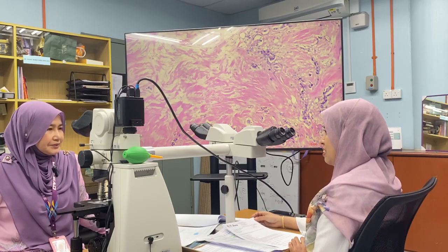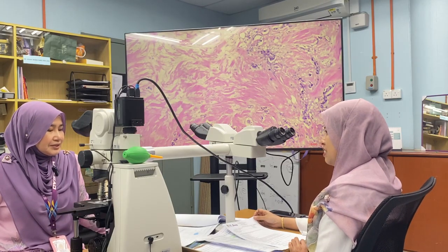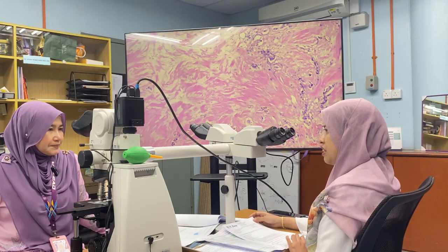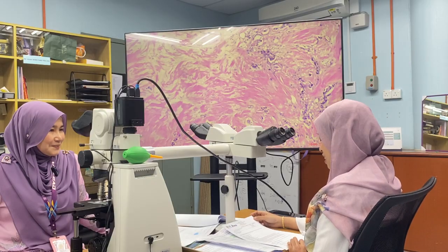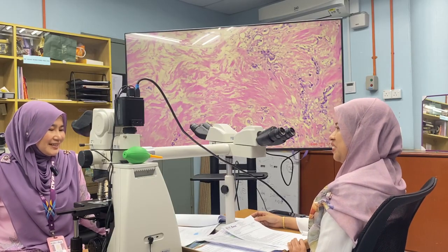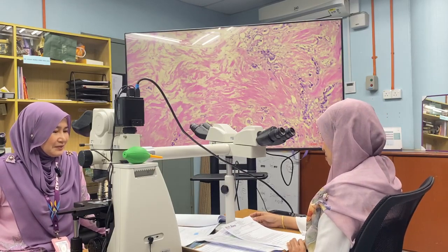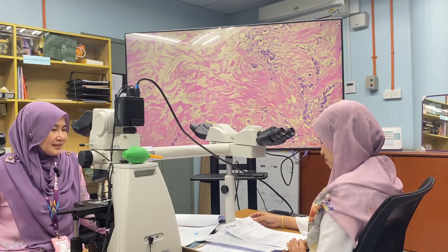So by right we need to repeat, right? Yes. So in this case, do you repeat? I repeat the HER2, which is negative in this patient. I think you did not repeat the ER/PR because it's already positive, right? Yes. That's good enough. But we repeat the HER2, and it is still negative, right?